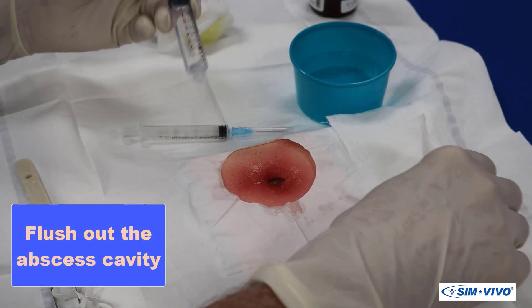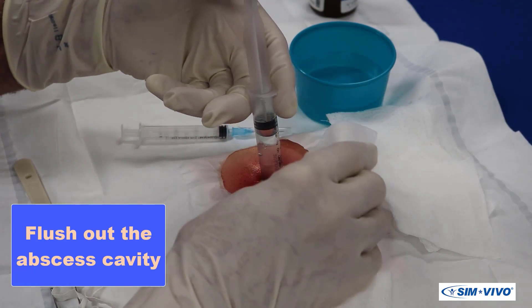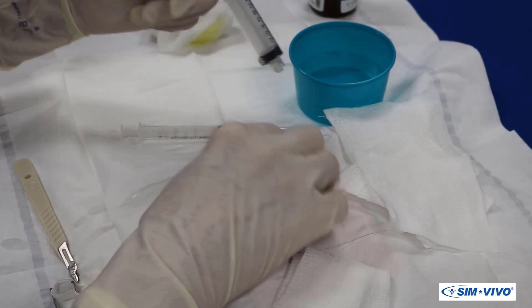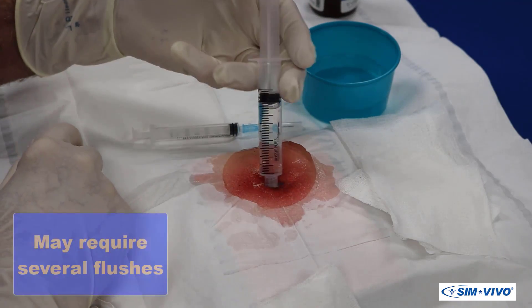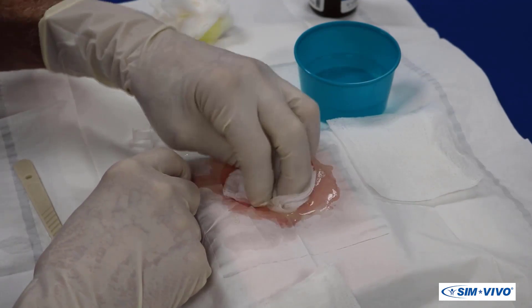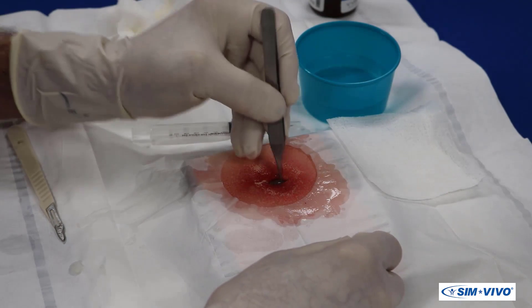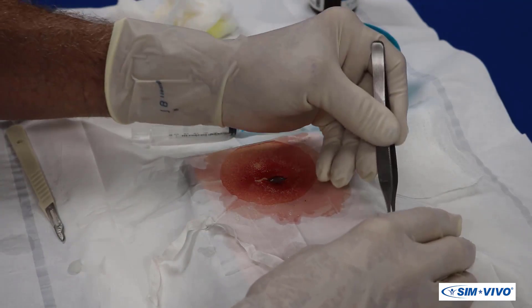Fill the 10 milliliter syringe with saline and flush out the cavity several times until the return is clear. You may want to insert the forceps or your little finger into the abscess to break up any loculations that will restrict complete drainage.